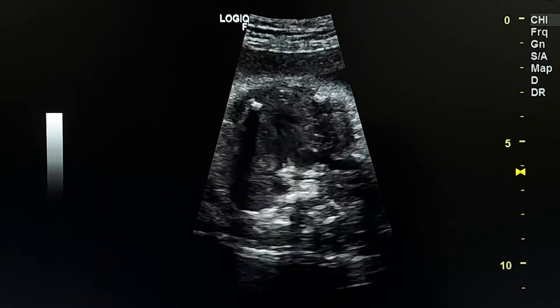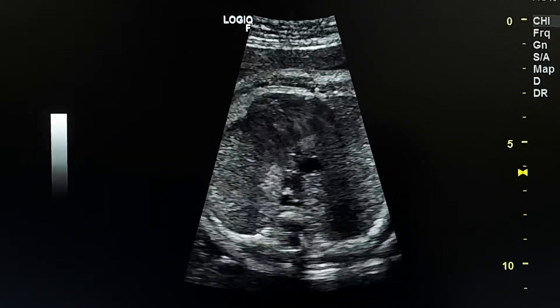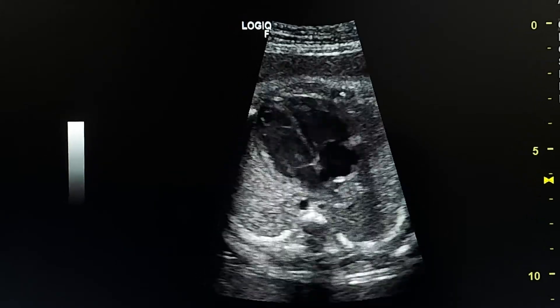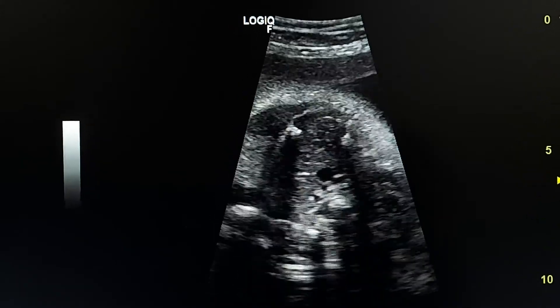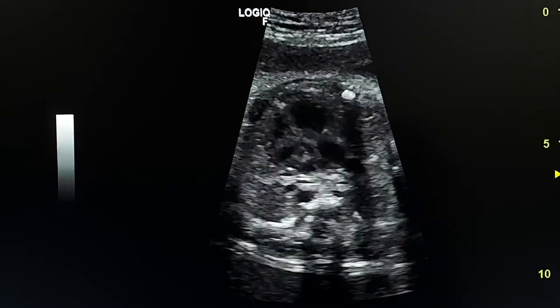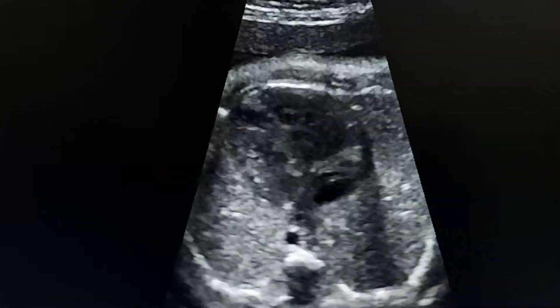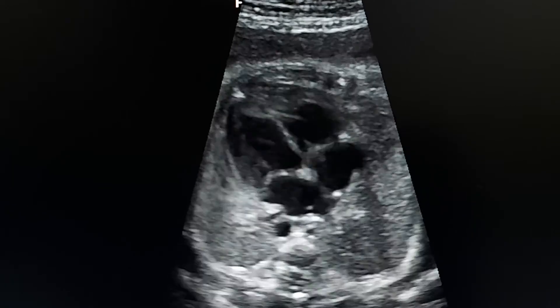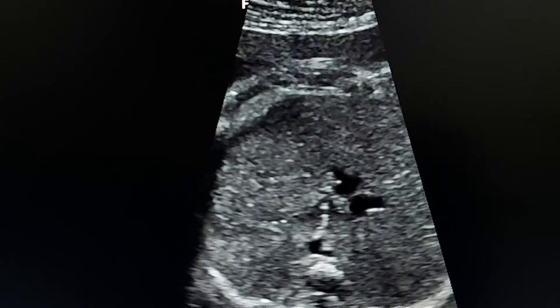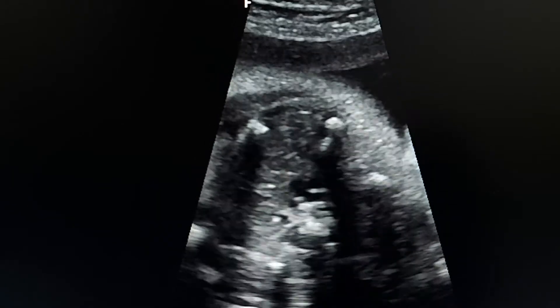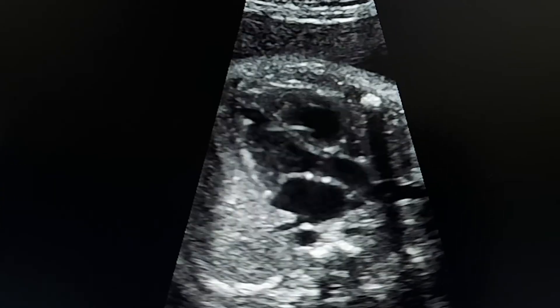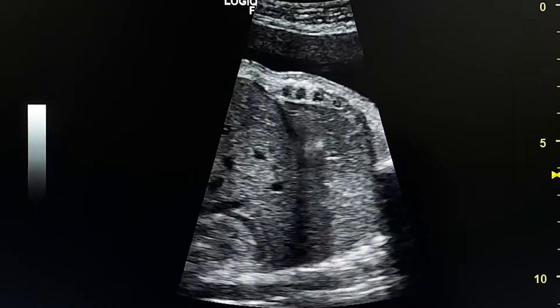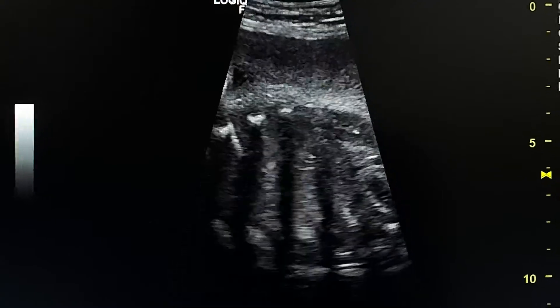Normal fetal heart at 33 weeks. We will review the 4-chamber view, 3-vessel trachea view, 5-chamber view, and sagittal sweep.